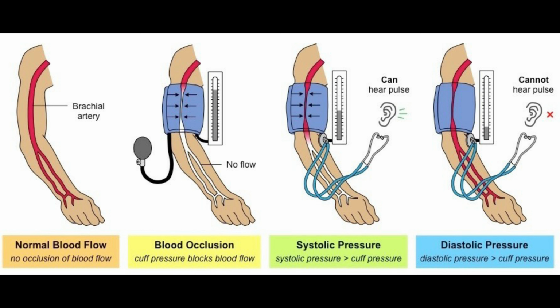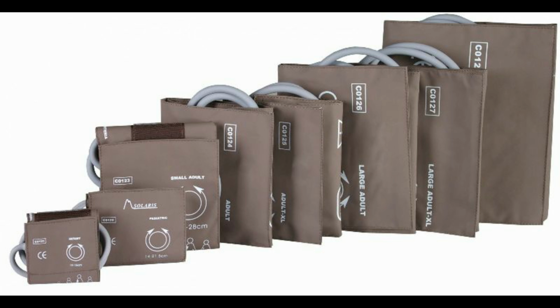The mechanical analysis revealed that the length of the cuff is required to be a specific fraction of the arm's circumference for pressure equilibrium, and this is the reason why you see different sizes of NIBP cuffs: adult, pediatric, neonatal, and in adult you can see triple XL for obese patients.